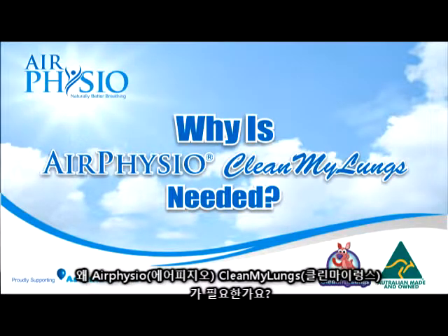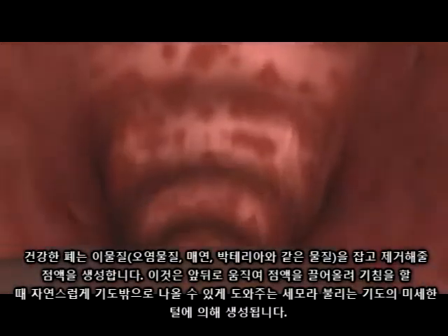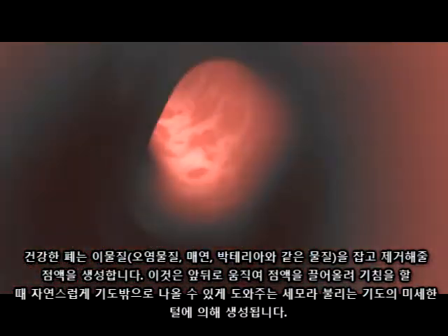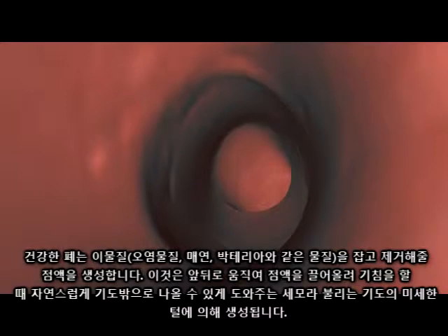Why is Air Physio Clean My Lungs needed? Healthy lungs produce mucus to help trap and remove foreign particles like pollution, smoke and bacteria from the lungs. This is performed by tiny hairs on the airway walls called cilia, which move back and forwards, helping move the mucus up and out of the airway to be coughed out naturally.